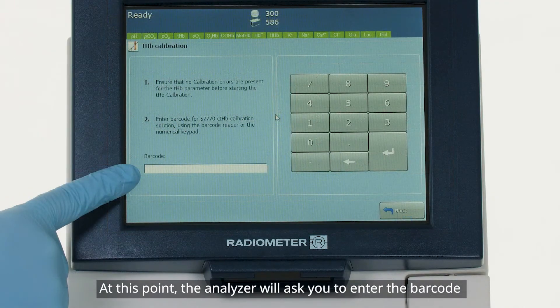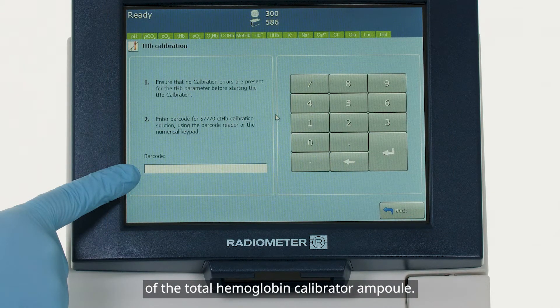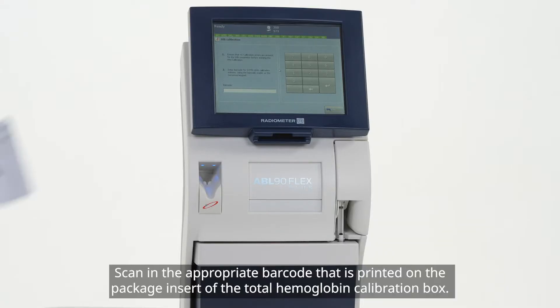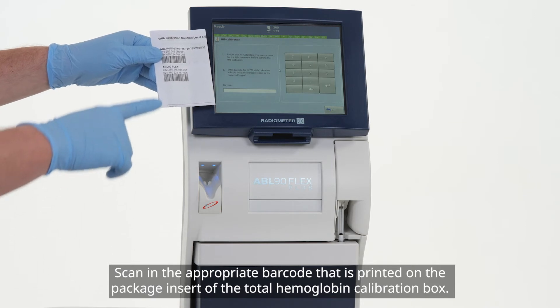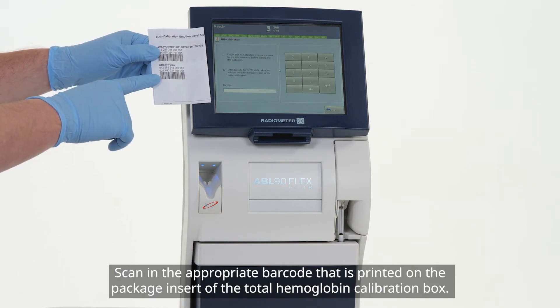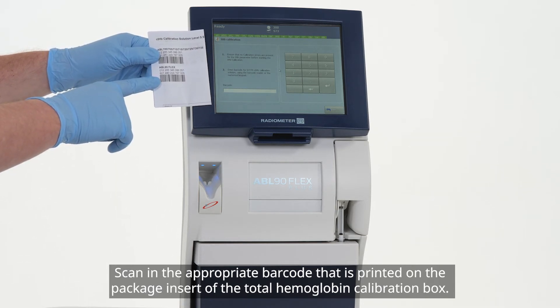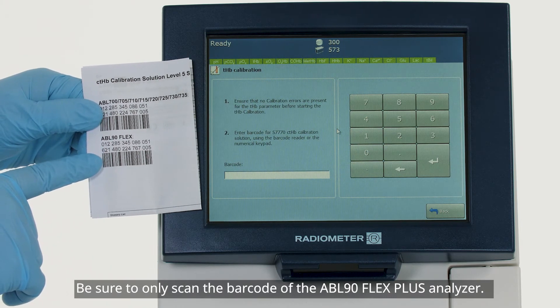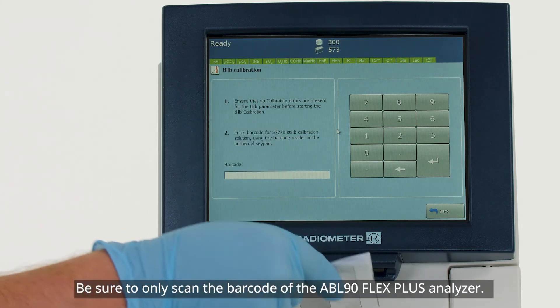At this point, the analyzer will ask you to enter the barcode of the total hemoglobin calibrator ampoule. Scan in the appropriate barcode that is printed on the package insert of the total hemoglobin calibration box. Be sure to scan the barcode of the ABL90 Flex Plus analyzer.